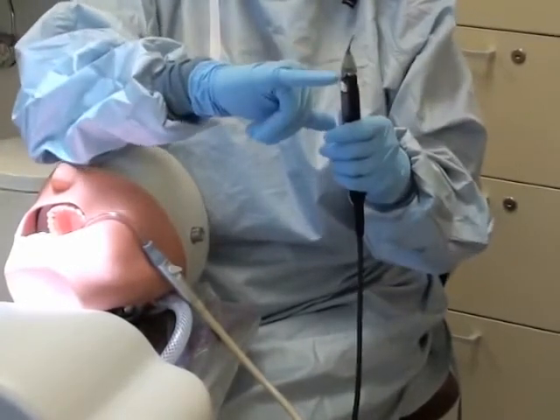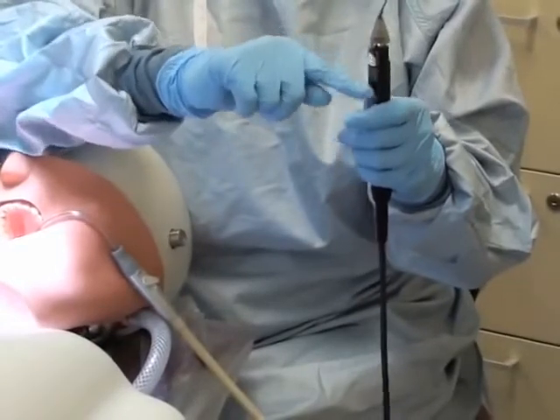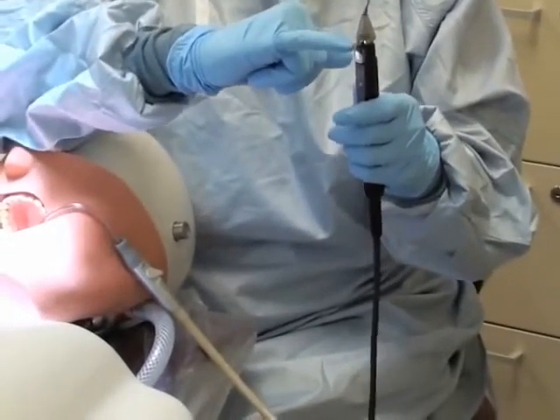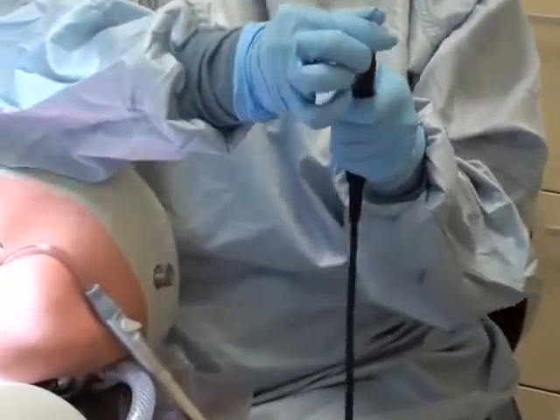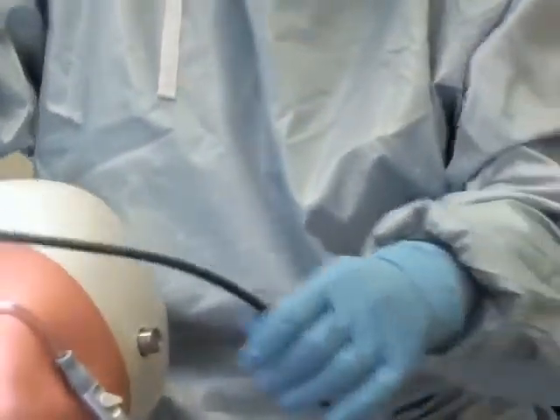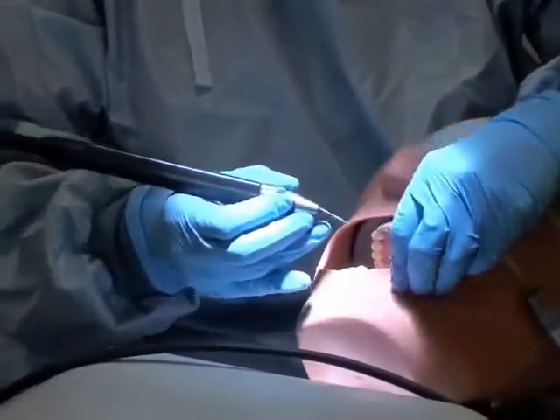The tip only goes in one way. The powder chamber connect is right here on the posterior of the handpiece. I'm going to push it down all the way until it clicks into place. You're now ready to begin.